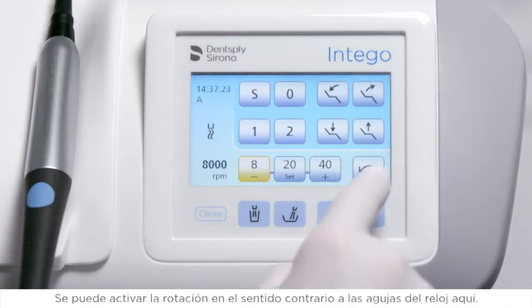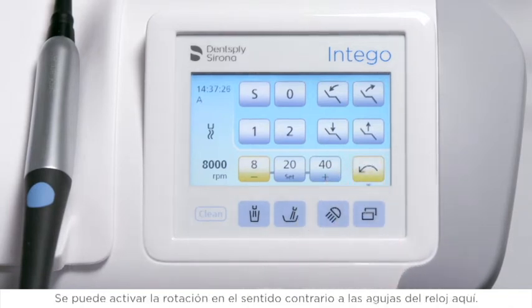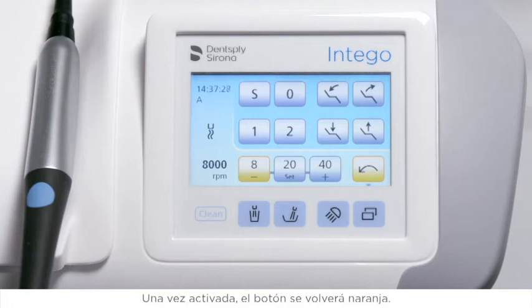Counter-clockwise rotation can be switched on here. The button is highlighted orange when activated.